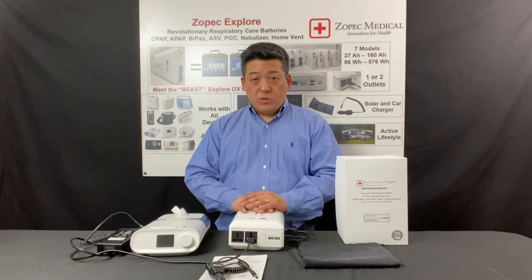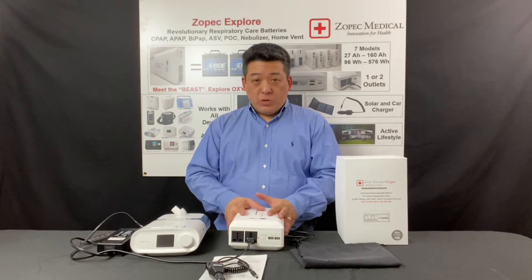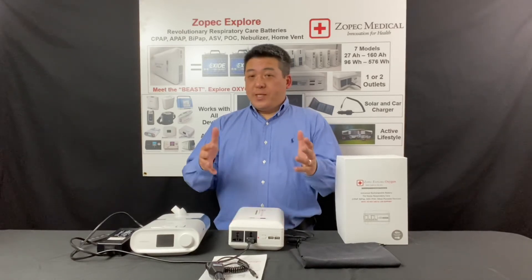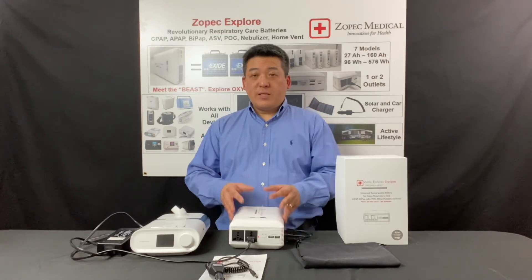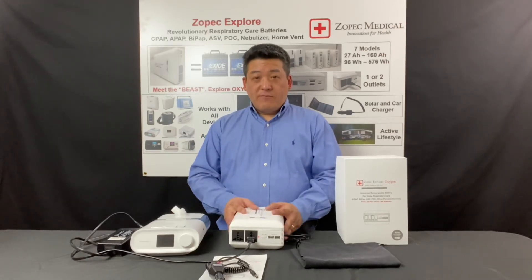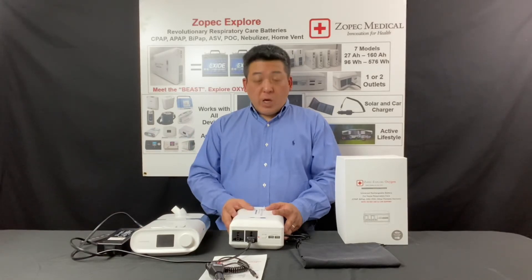You can do that and see if it will stay at 100%. If there are any issues, please call us or contact us at Zopac Medical. You can find our contact information on our website and we'll help you right away.